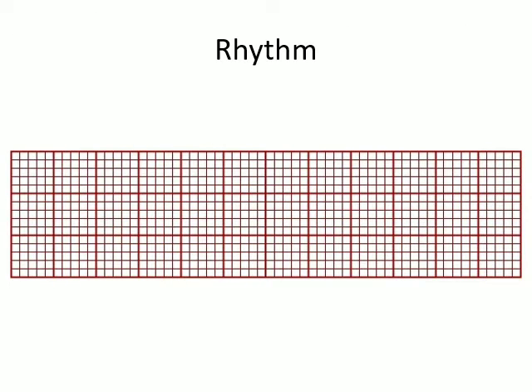Again, I'm going to draw two QRS complexes. In this case, what I want you to do is to look at multiple QRS complexes and look at the RR intervals. If I draw a next QRS complex here, and the next one here, and the next one here, I'm sorry for my really terrible drawing, but just consider this as being a normal QRS complex.